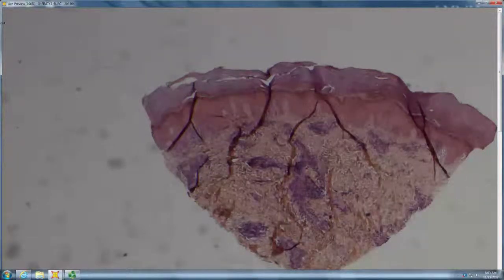I can't tell exactly what cell type that is. I was going to say lymphs, because they kind of look lighter than lymphs. Yeah, they're kind of lighter than lymphs. You certainly have a few eos, and you've got some neuts, and a little neutrophilic debris, and your vessels are kind of roughed up, and there are some neuts and some karyorrhexis there, but the whole thing looks kind of weird, right? I agree. So, first off, you could think of drug with mixed patterns, you could think of viral, you could think of syphilis. History in this case would help.